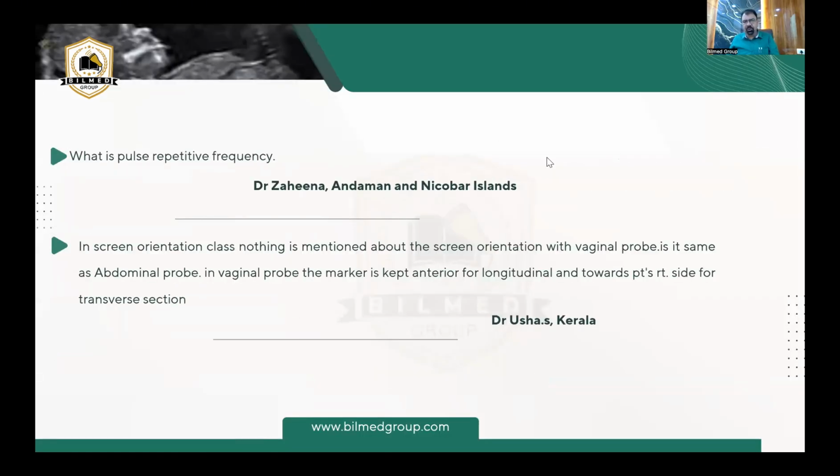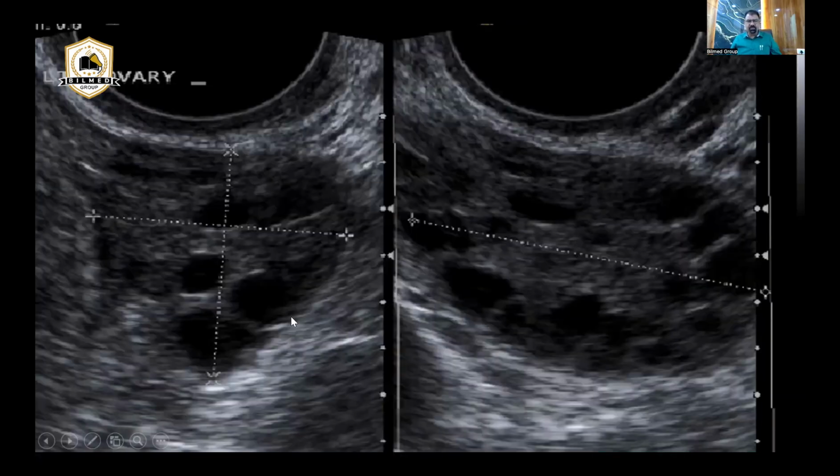What is pulse repetition frequency? Now see, some doctors are getting confused between frequency and pulse repetition frequency. I don't have any slide of that, but try to understand. Frequency has nothing to do with pulse repetition frequency. Pulse repetition frequency is PRF.